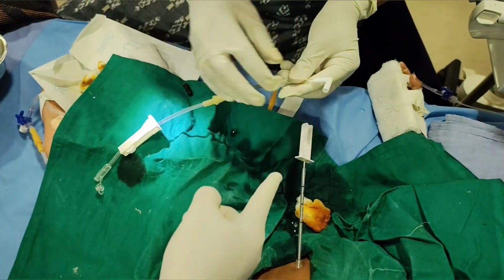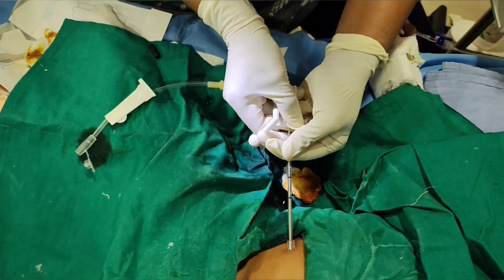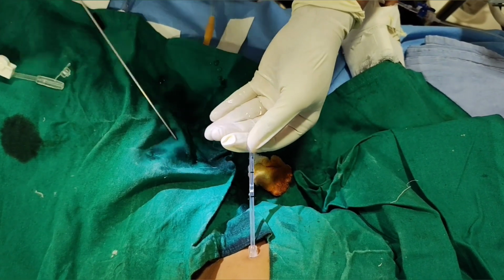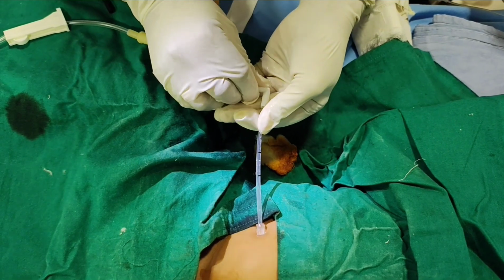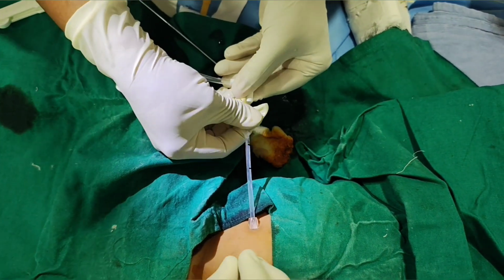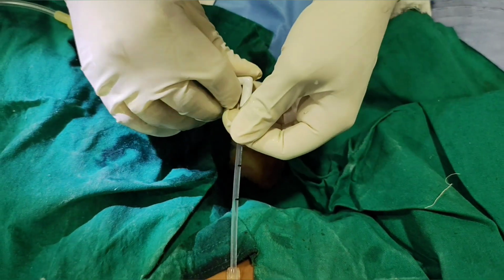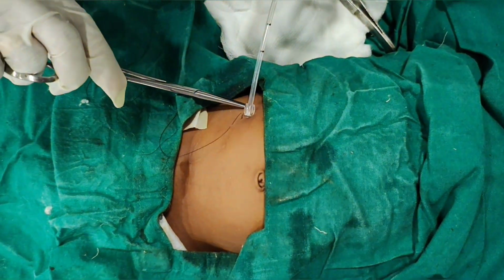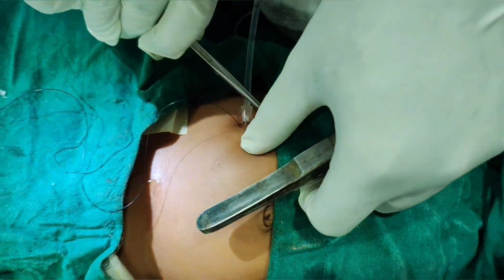Now we have to connect the PD catheter to the trocar cannula. Now secure the catheter to the skin with a superficial purse-string suture.